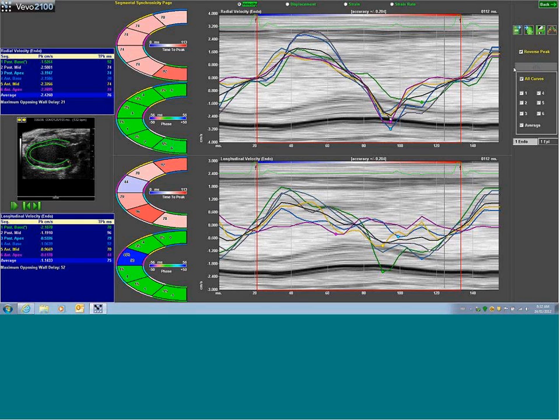So the next thing I want to mention is exporting data. For this particular snapshot here, you can export the picture. If you put your cursor over this button here, you can export any of the pictures you see in JPEG, BMP, or TIFF. You can also export the data. If I click on this button, it'll give you some options to do all curve data or just displayed curves.